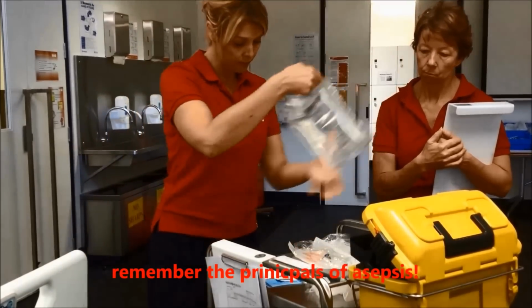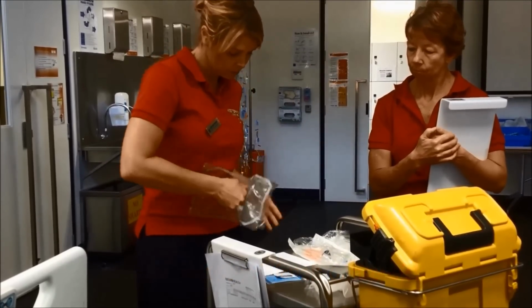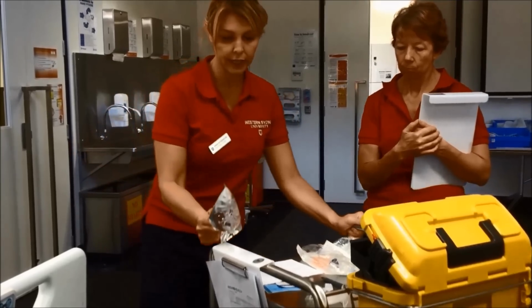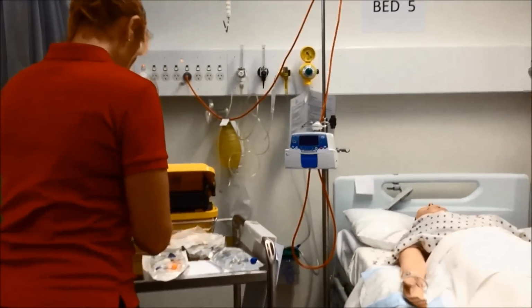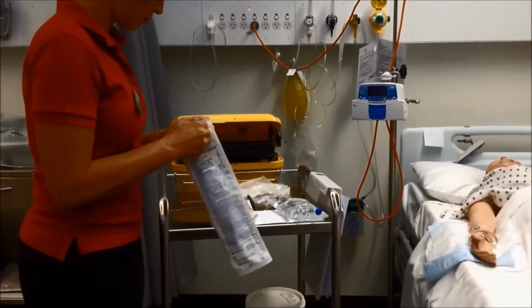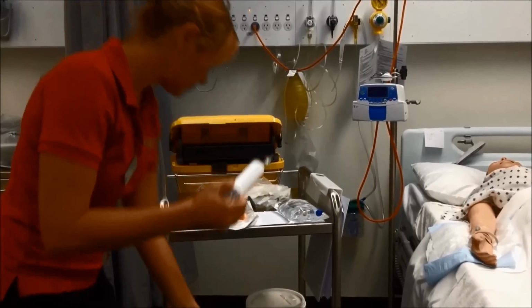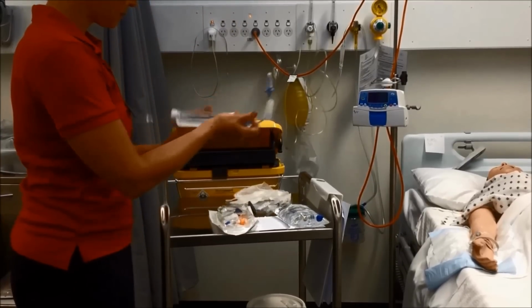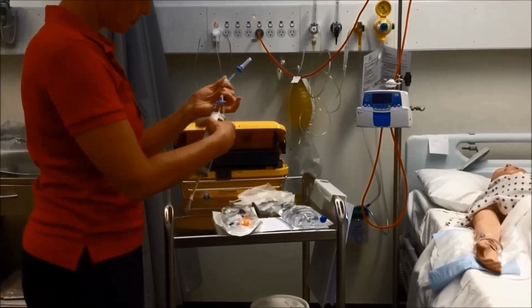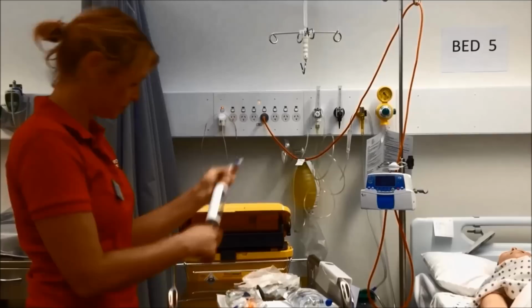Alright, I'm going to prime my line. I'm going to do that over here. I'm going to put the clamp down here rather than on the top, otherwise it will leak.